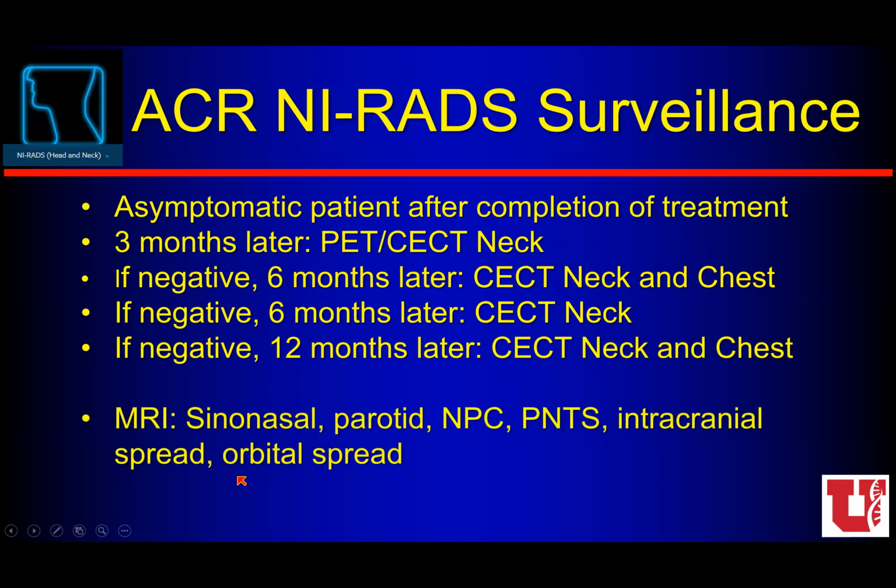Now, we did add MRI after some arguing. So especially for sinonasal cases, parotid, nasopharyngeal carcinoma, perineural tumor spread, and intracranial spread and orbital spread are easier to see on a contrasted MR, so that was added later.